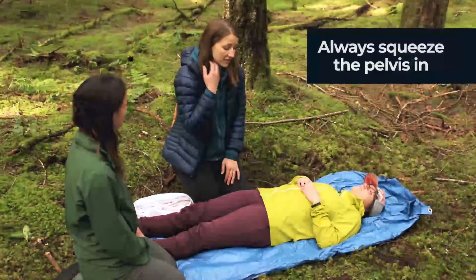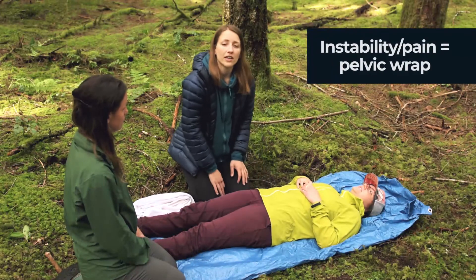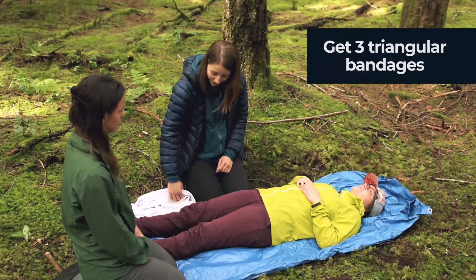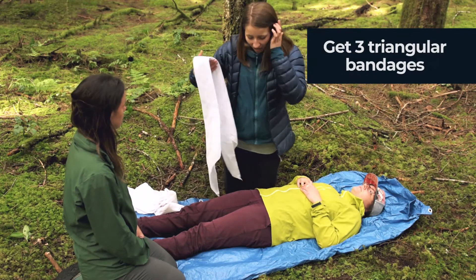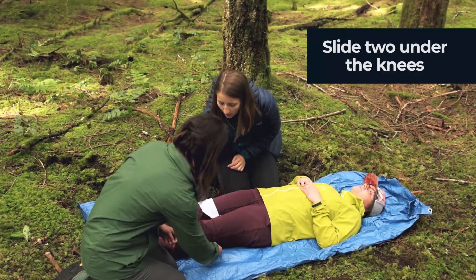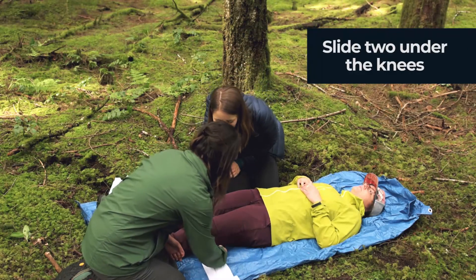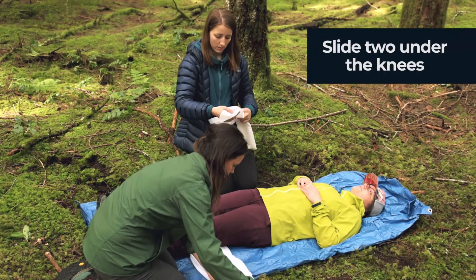We'll show you how it's done. When we examine the pelvis, we always push in and never down. If you feel any instability or your patient is in any pain, then we're going to put a pelvic wrap on the pelvis. To do this, we're going to take three triangular bandages and make a pelvic corset. I'm going to take one narrow bandage and slide it underneath her knees — I'll slide two under there, just so we have them all ready, and then we'll shimmy them into place once we've got them all underneath her.